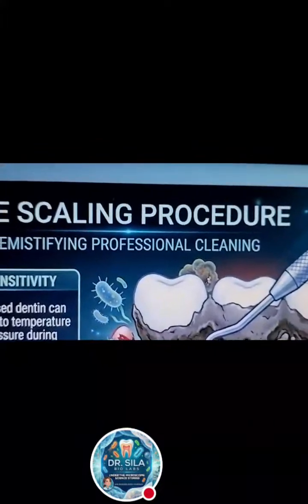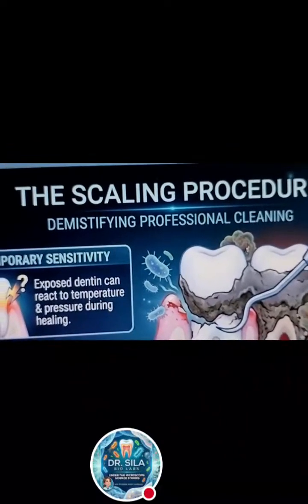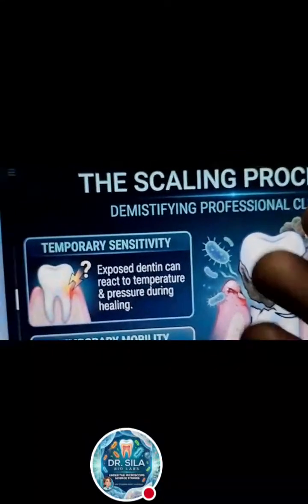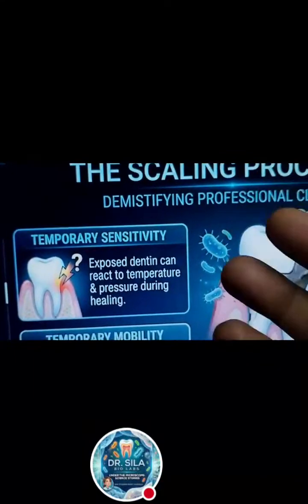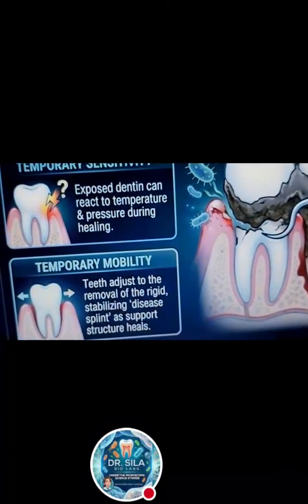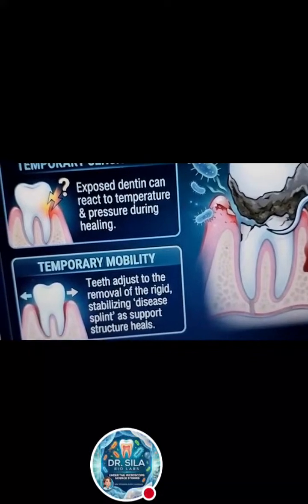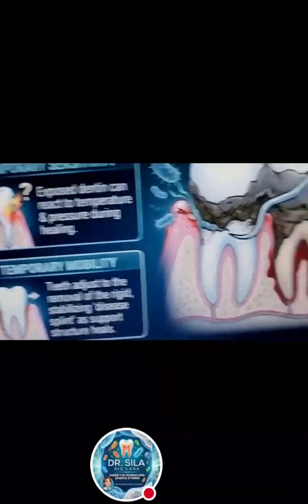Now, what is the scaling procedure? Demystifying professional cleaning. Temporary sensitivity: exposed dentine can react to temperature and pressure during healing. Temporary mobility: teeth adjust to the removal of the rigid, stabilizing disease splint as a support structure.